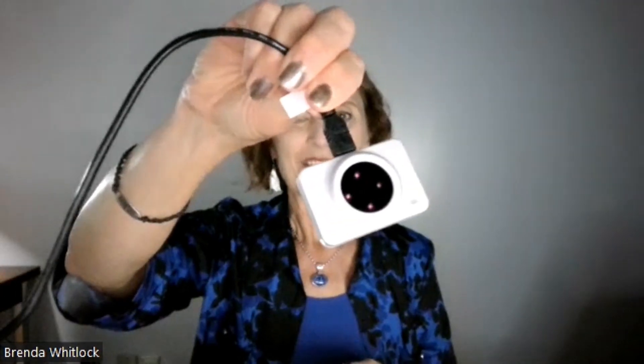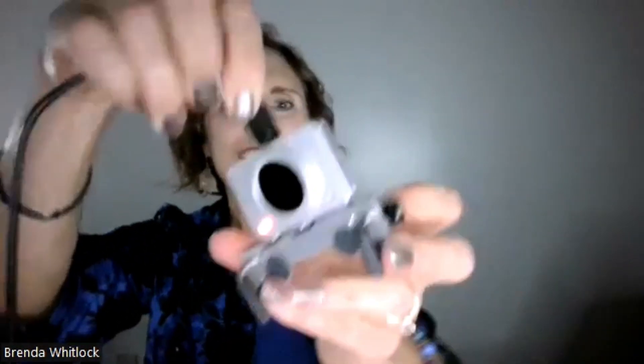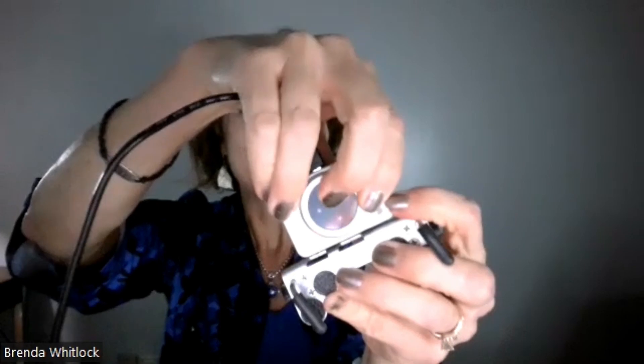We're going to take the cord and connect it on the top side into the port on the Head Mouse. The other end is the USB, and we're going to put that into the laptop. As soon as I connect that, you can see the red dots. The back of it has Velcro, and we'll connect that to the mount.